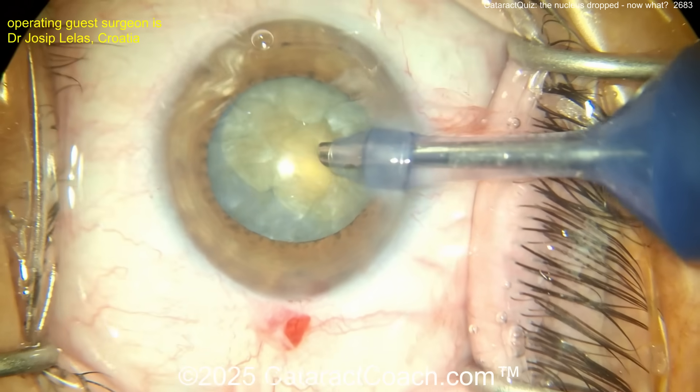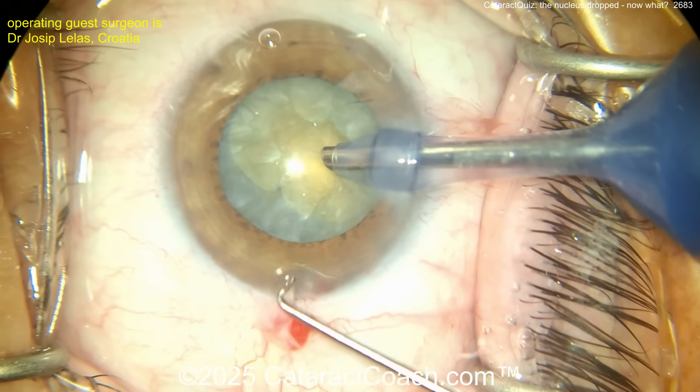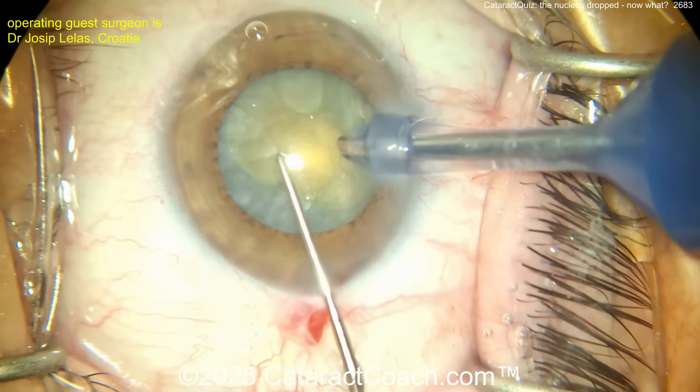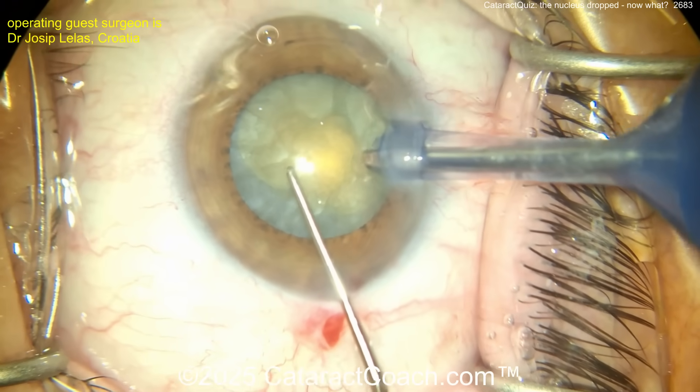Chopper going in. Perhaps a chop technique here. Maybe we're going to do a groove down the middle — maybe stop and chop. Let's take a look.